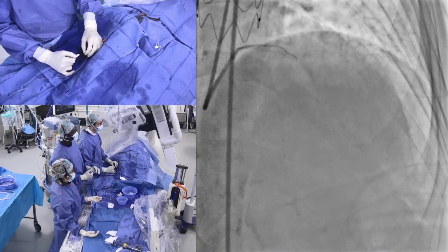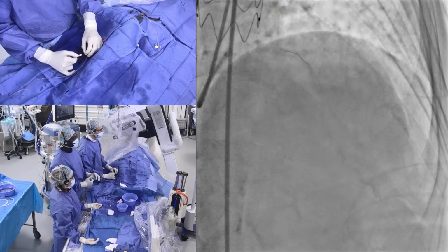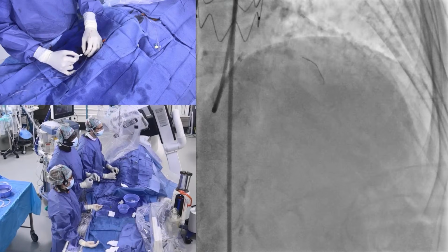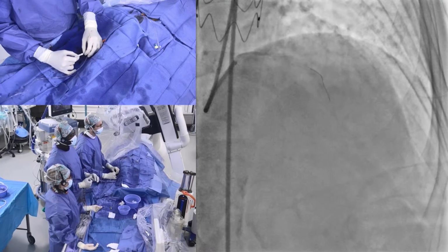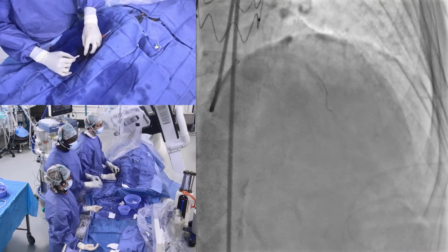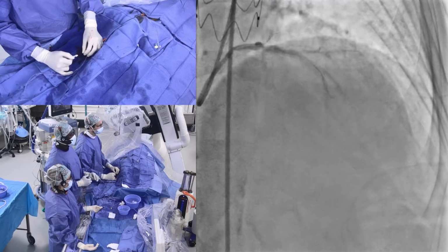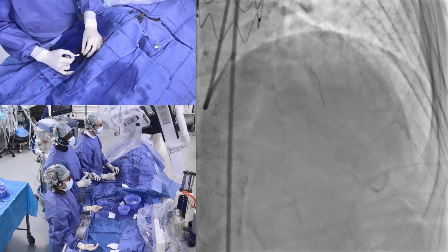So I agree with you. Let's give it a try to see how this RotaWire works on its own before thinking of other options. And what seems quite obvious with that wire is that you can clearly see by the way the tip moves that it's more torqueable. It seems to be more like a one-to-one response with the torque that you apply to the tip of the wire.